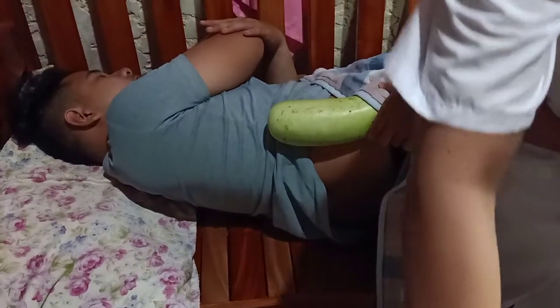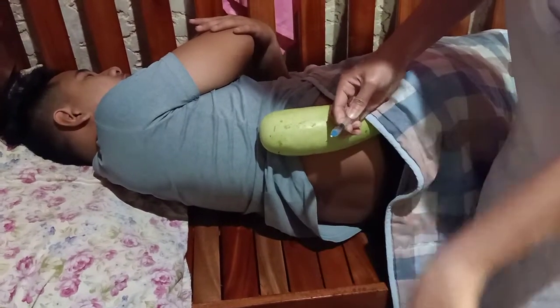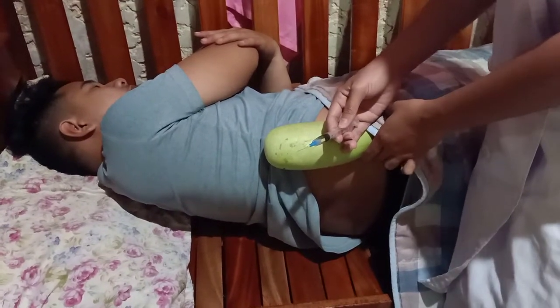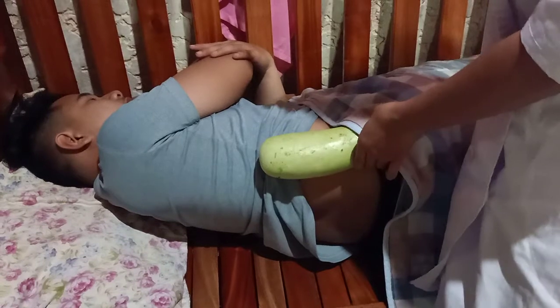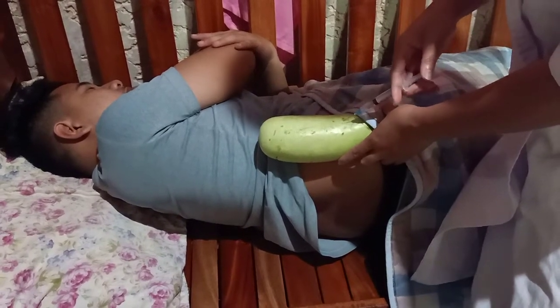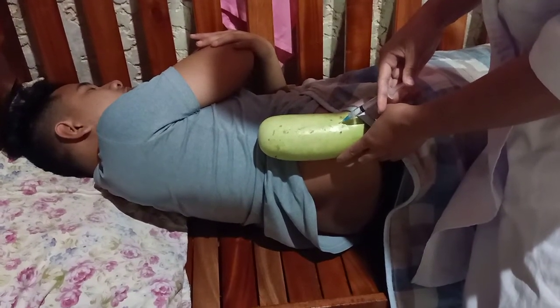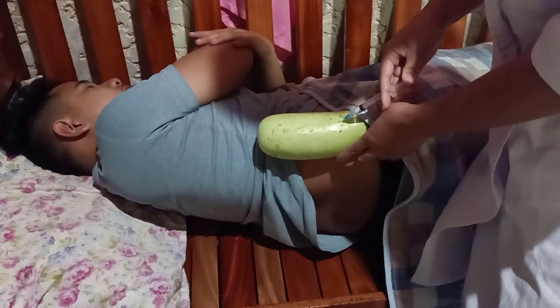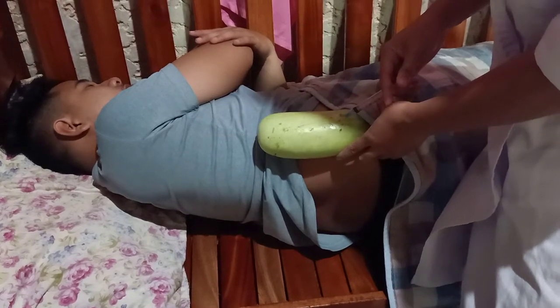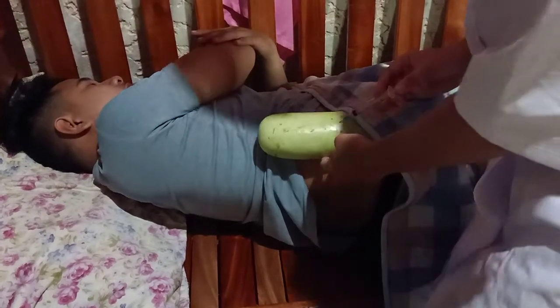So, inject the medication slowly at the rate of 1 ml per 10 seconds. After 10 seconds, slowly withdraw the needle.